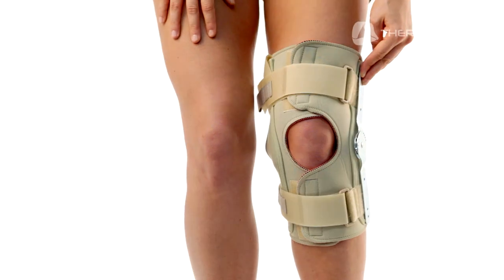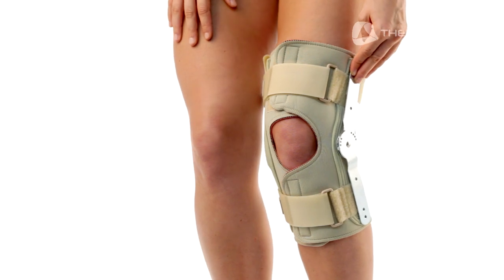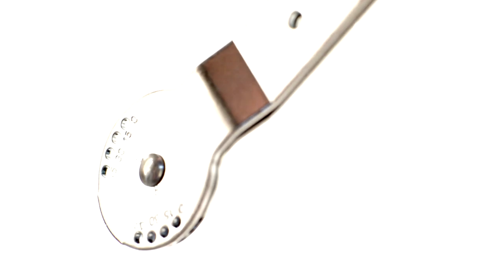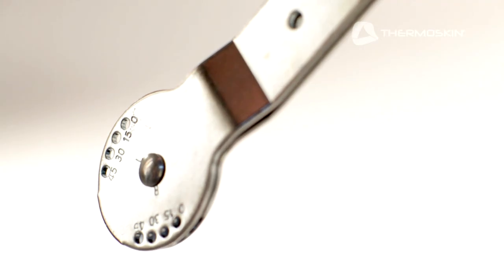The Range of Motion Hinge offers exceptional support and stability after knee surgery and through post-operative rehabilitation. The precise 15 degree range of motion adjustment options help maintain a selective range of flexion and extension.